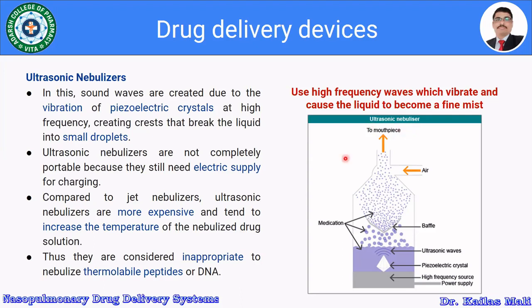Here in the case of the ultrasonic nebulizer, we are using high frequency waves which vibrate and cause the liquid to become a fine mist, right? So the sound waves are created due to the vibration of a piezoelectric crystal at a high frequency, creating crests that break the liquid into small droplets. Ultrasonic nebulizers are not completely portable because they still need an electric supply for charging.